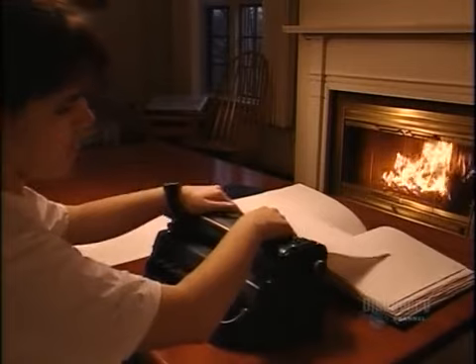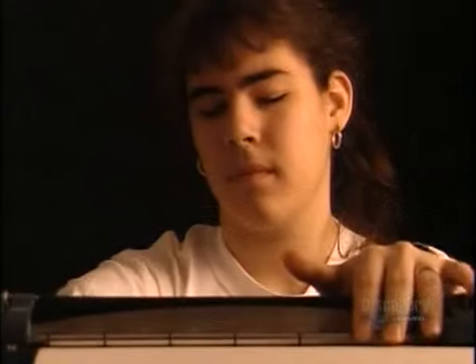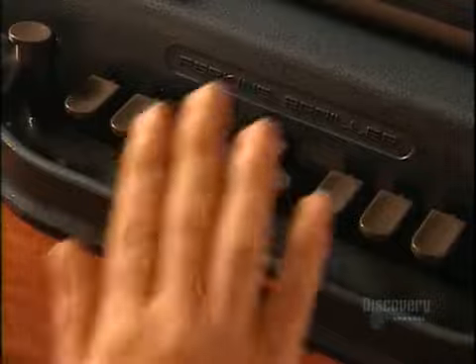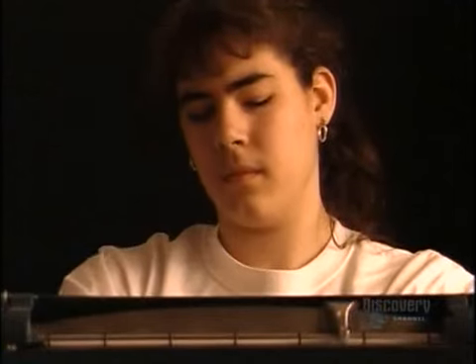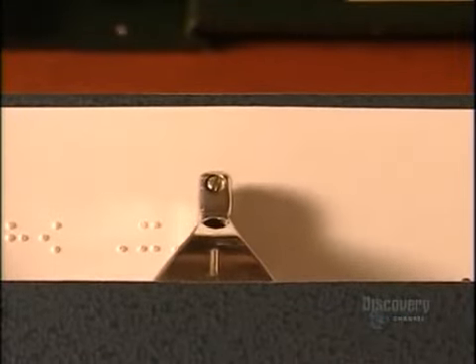Typing on a Braille writer is an embossing process, so you have to use thick paper. You push single keys and combinations of keys to produce different configurations of dots, each signifying different letters of the alphabet.